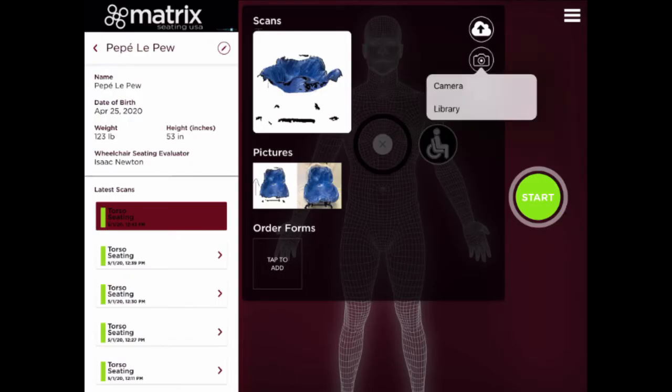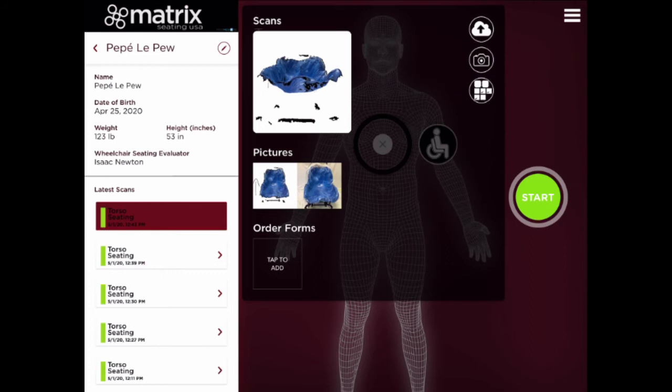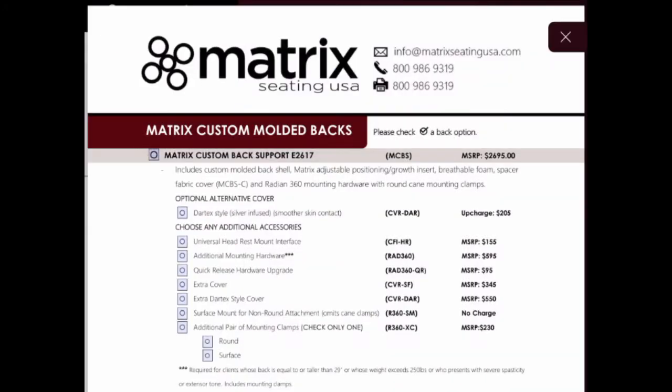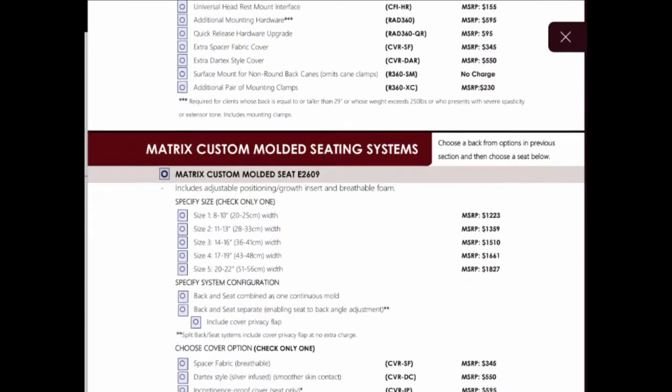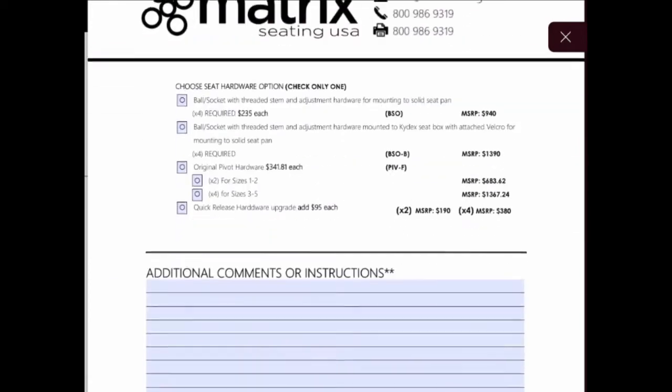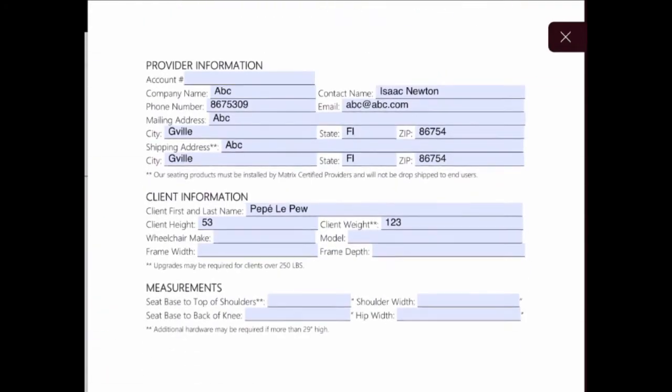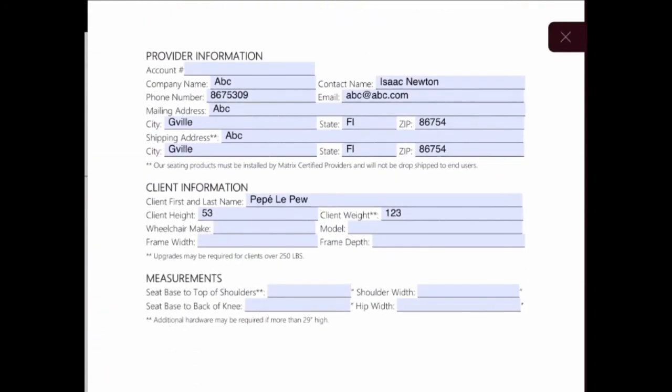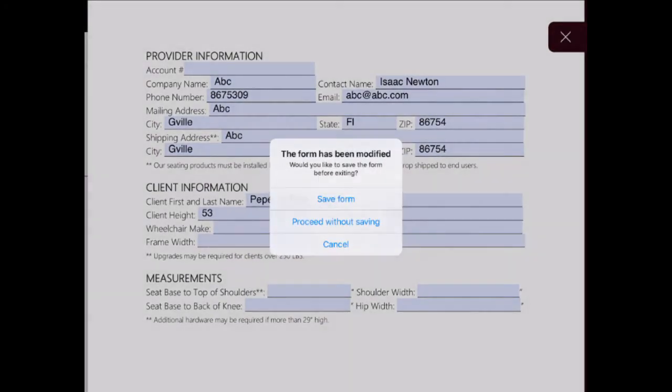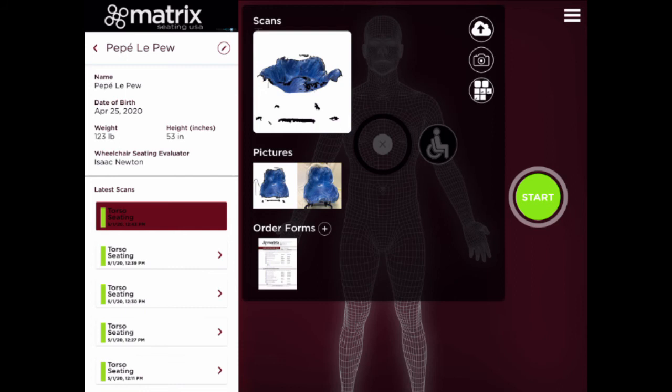Your scan will then appear in a black box along with any photos. To add your order form, simply click the Tap to Add box under the Order Form section. Fill out your order form and once your order form is completely filled out, click the X in the top right hand corner to save your form. It will now appear under the Order Form section.